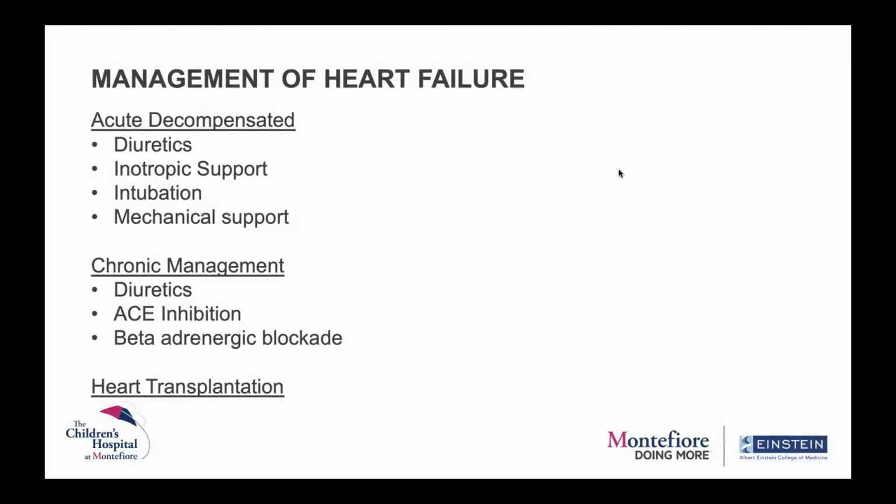So either it is ECMO, you might have heard that, extracorporeal membrane oxygenation, which is like a heart-lung machine, or you're given a VAD, which is called a ventricular assist device. Chronic management of heart failure is done in an outpatient setting where patients are at home. There are certain medications like diuretics, ACE inhibitors, beta blockers that we use in these patients. And of course, we all know that the gold standard of treatment of heart failure, if not recovery, is heart transplantation. So today we're going to be talking about mechanical circulatory support in acute heart failure.